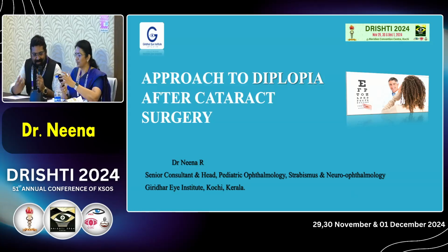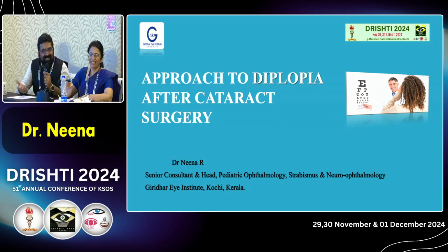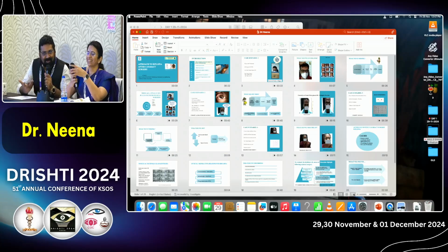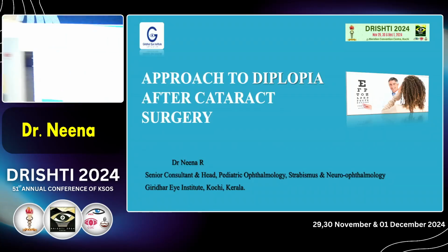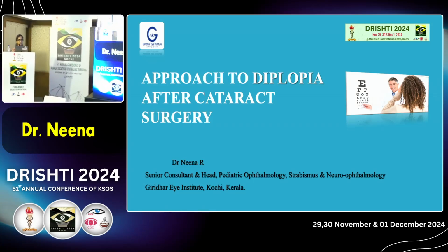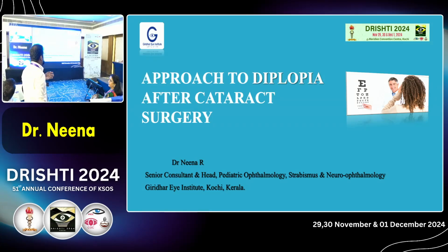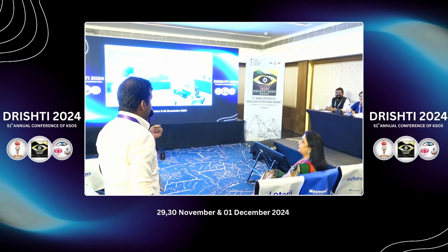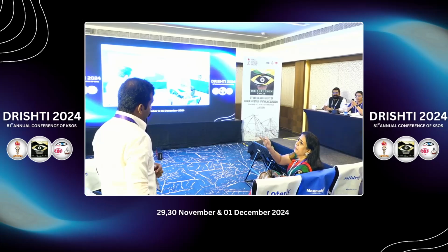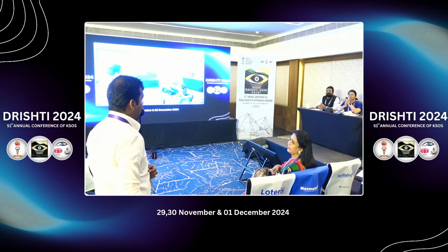First of all, the patient should be unhappy. If he is not unhappy, then we don't do anything, leave it like that. As a continuation of the previous question, there was some discussion that because Sulcoflex lenses were not available, ICLs can be used in place. The cheaper ICLs. Okay, so there's no cost advantage anyway.